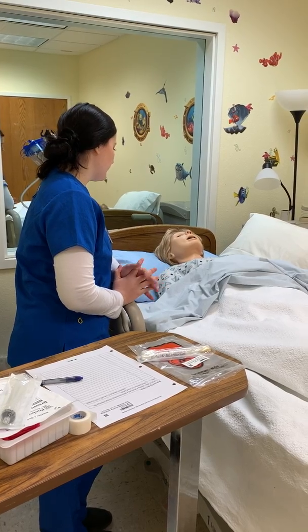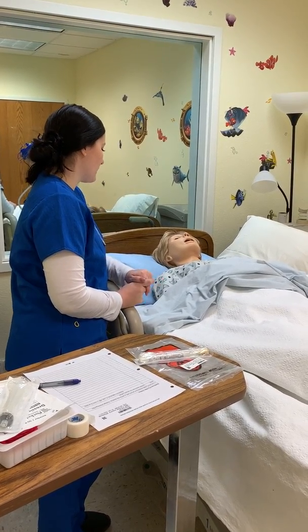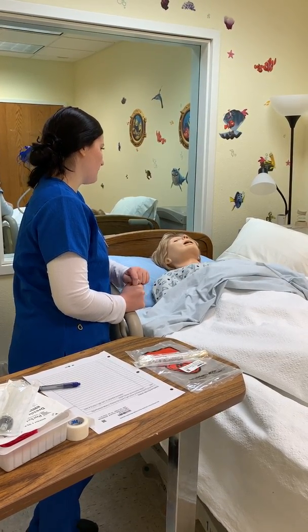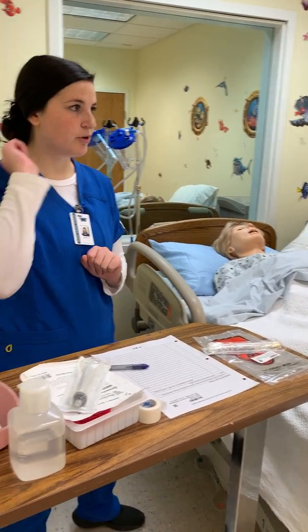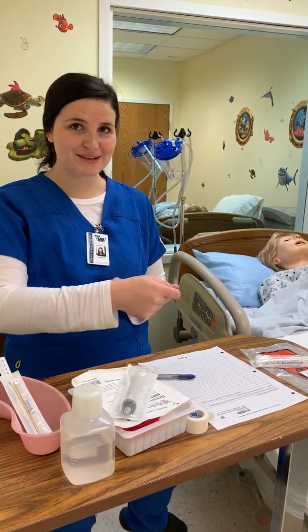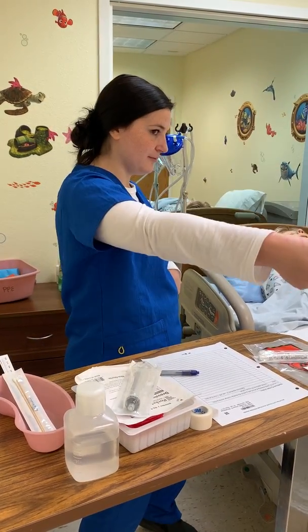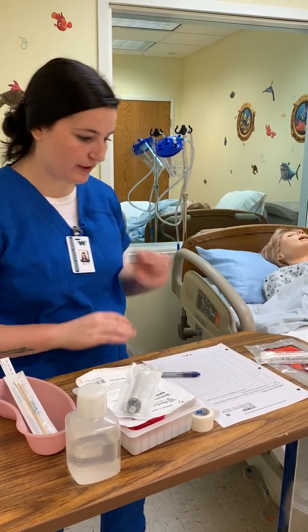Do you feel like you're going to need any pain medication before we begin? No, you're okay. Can you rate your pain on a scale of 1 to 10, 10 being the worst? Oh, you're feeling good. You're only at a 3. Okay, awesome. So I'm going to go ahead and provide patient privacy with a closed door and a curtain. I'm going to perform hand hygiene, and I'm going to get everything ready.